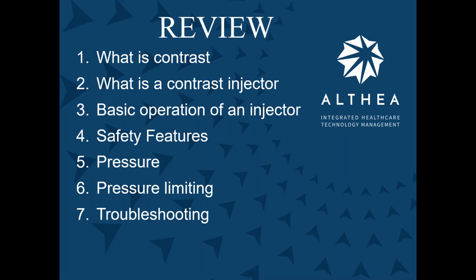Every one of them will say, did you check for air? You have to acknowledge that you check for air in the lines. That is the manufacturer's way of saying, hey, not our fault anymore. Every one of them, you have to say, check for air.